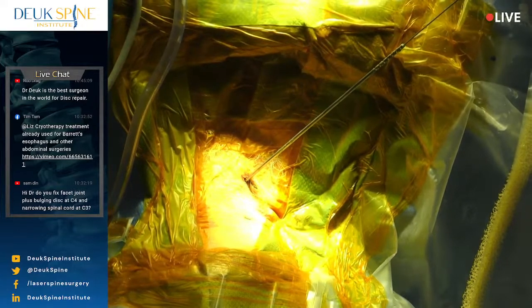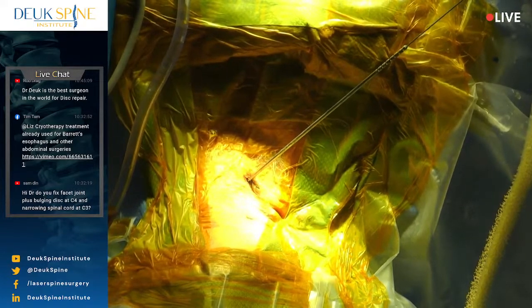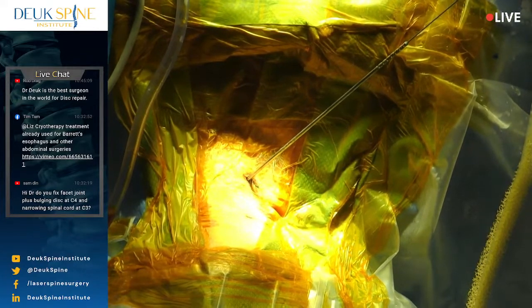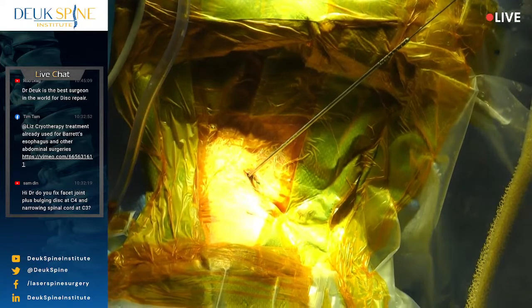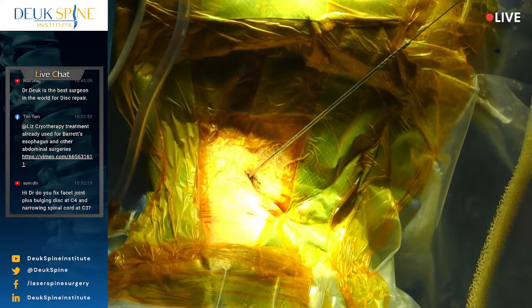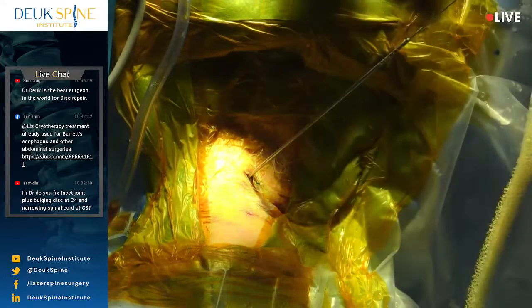I will need Luis eventually to pull the shoulder a little bit. All right, let's try it. Let's see. Pull a little bit. Well, let's just see what we do on the shoulder. Gentle shoulder. Let's see what we got. Yeah, I brought it down a little bit. So not yet. I'm not ready yet.